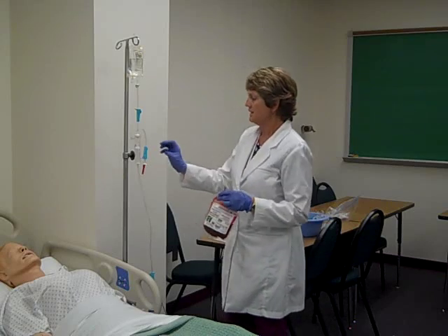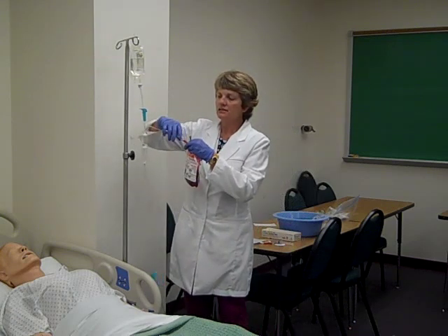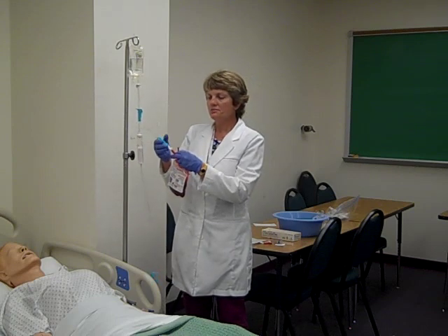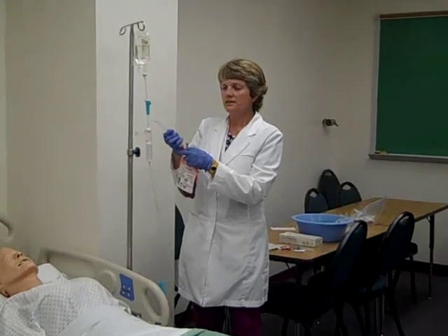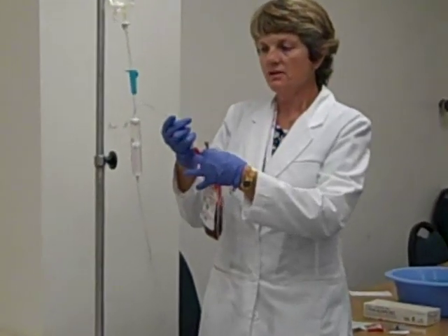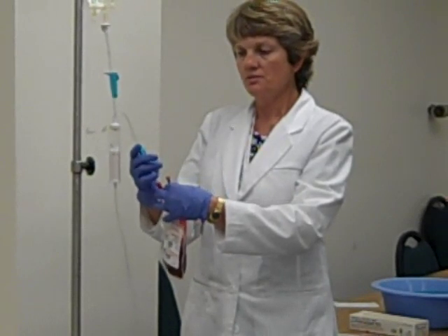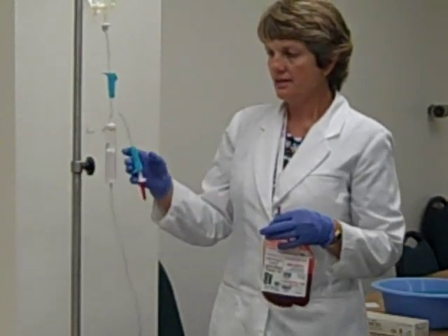I'm going to go ahead and, before I actually spike the blood bag on this Y port, I'm going to actually prime this Y port. And I'm just going to prime it by loosening the cap and opening the clamp on this Y arm. And just by gravity, the normal saline should prime that little tube in, which it did, and it is, okay? And there, that's all primed.